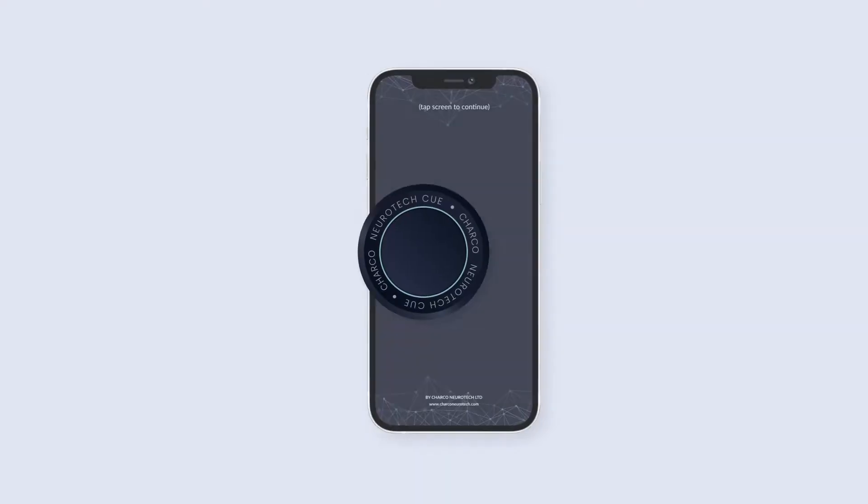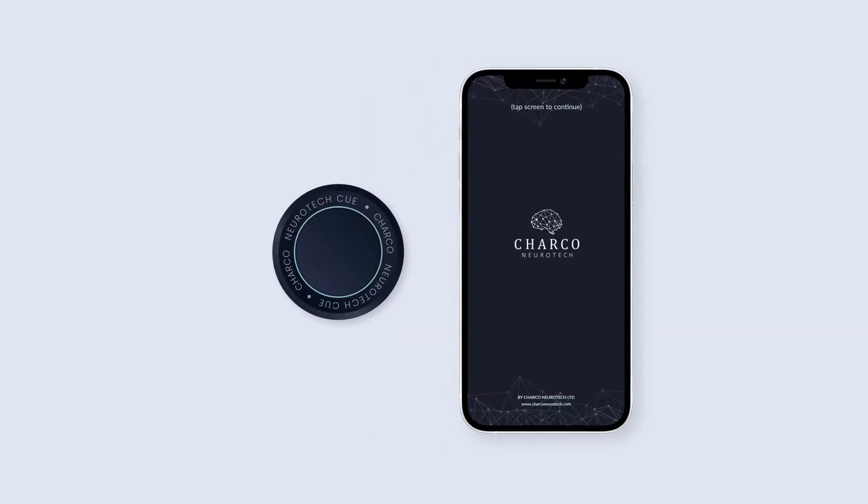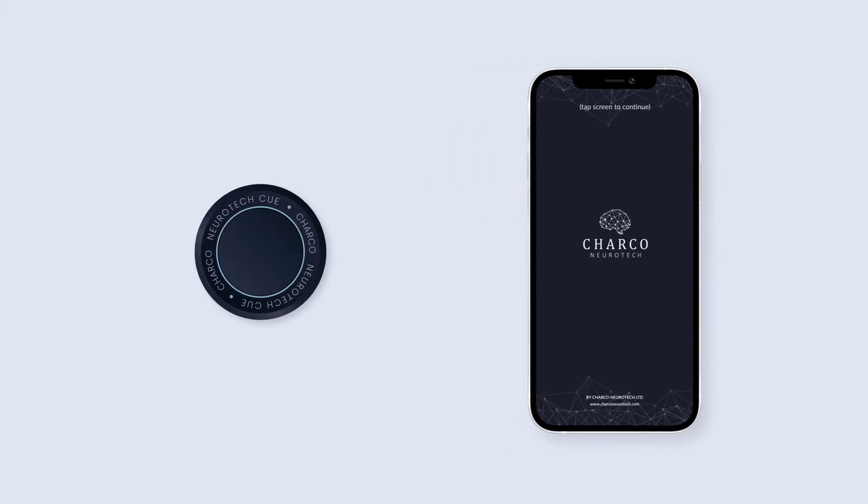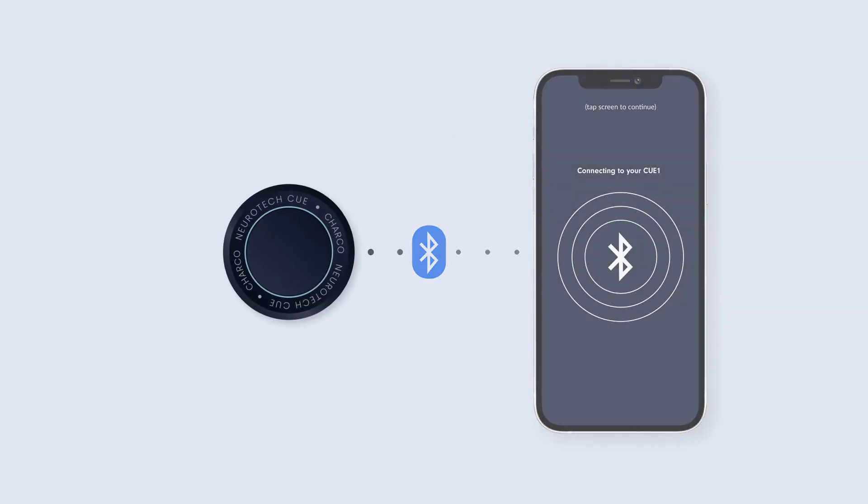It can be used as a completely standalone device, but can also be used in concert with our CUE App. By connecting your CUE1 to the app via Bluetooth, you can alter the characteristics of the vibration it delivers to suit your personal preference.